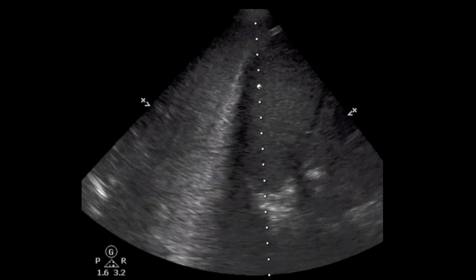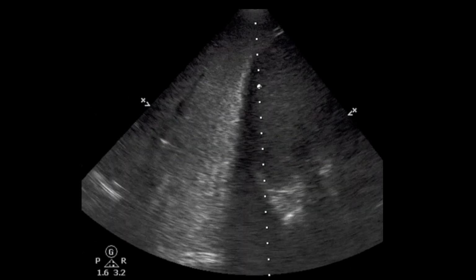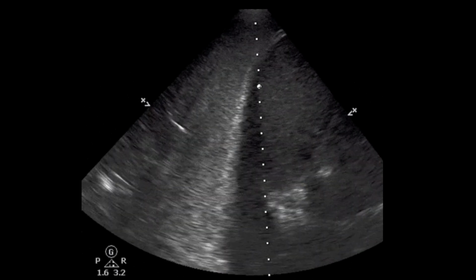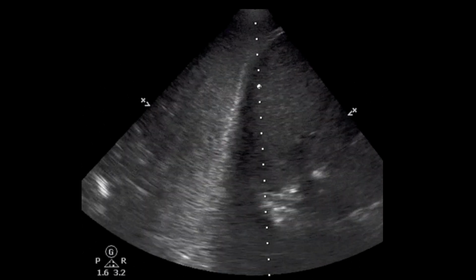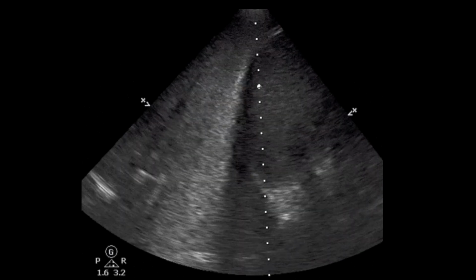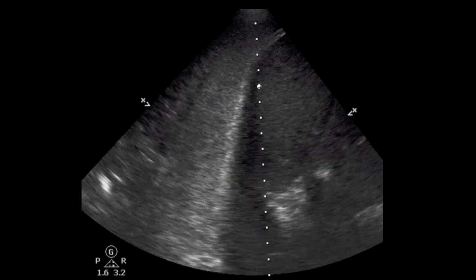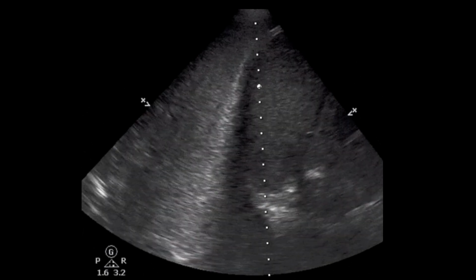It doesn't matter what it looks like, if you see that, it's pneumonia. There's nothing else that gives you this little thing. And we've had a patient that we've seen that. Then there's consolidation. Now, not all consolidation is infective, just keep that in mind. It could be other things, but at least there's consolidation.